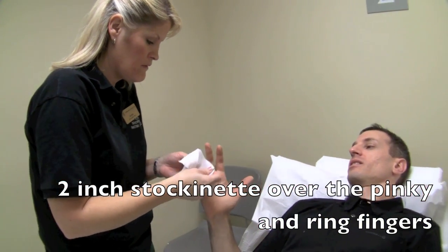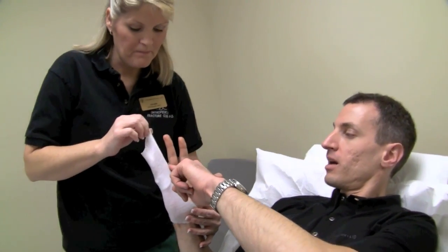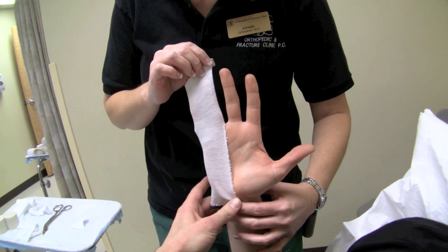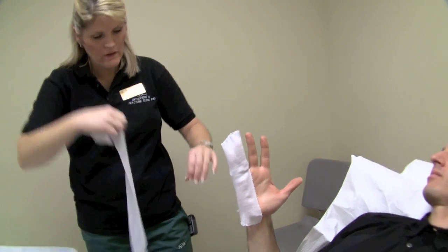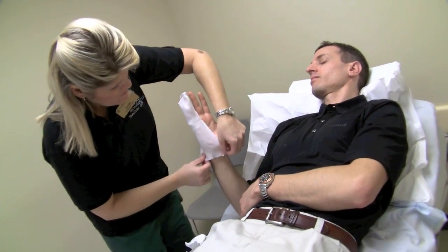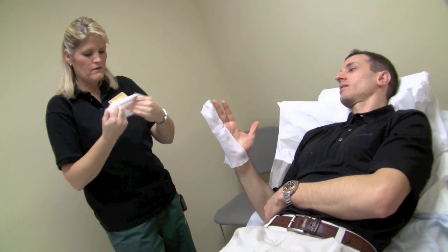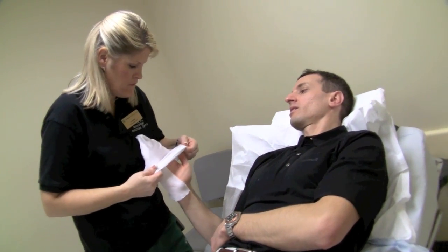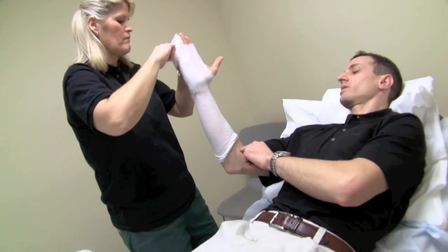Number two is another stockinette that has a slit in it — about half of its length. The slit part goes over the ulnar aspect of the hand, and the intact part goes over the fingers. Then there's another sock for your whole arm — thumb goes through the hole. Sock number three covers the arm just about up to the elbow, making sure there are no creases.